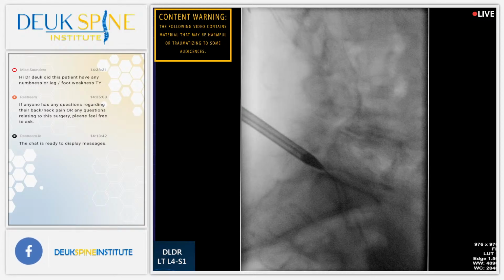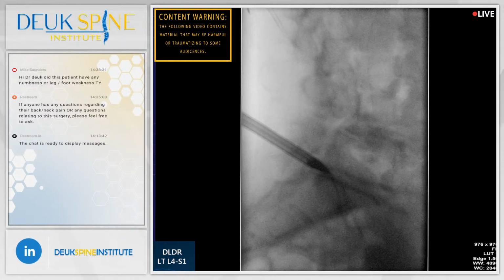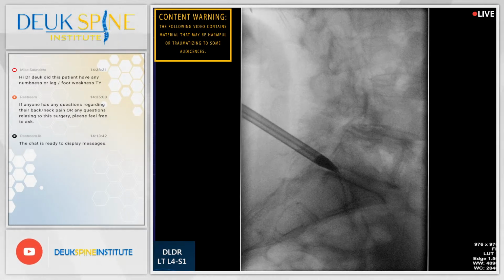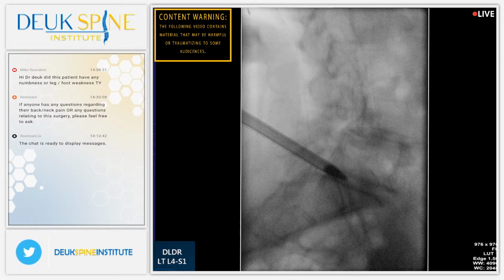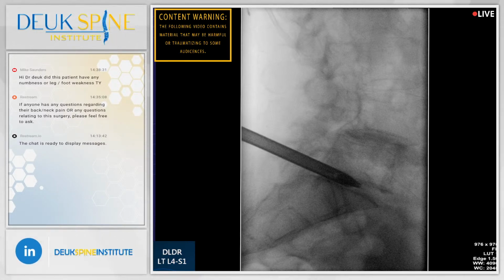Nope. Shot. Good. So I've gotten, hold on, gotten everything. Let me see. Shot. About as perfectly positioned as I can. Go ahead. And now we're going to place this. Yep, there we go. Good, good. We're going into the 5-1 disc space. Just about done.